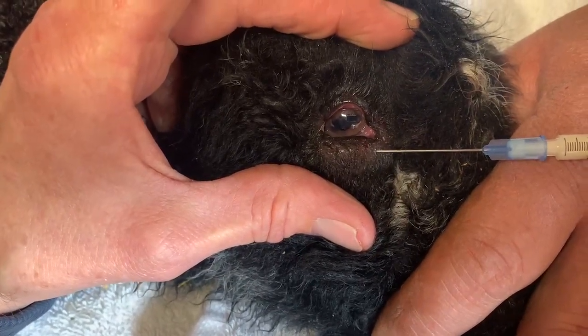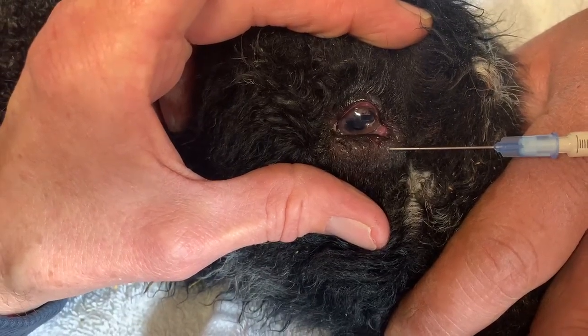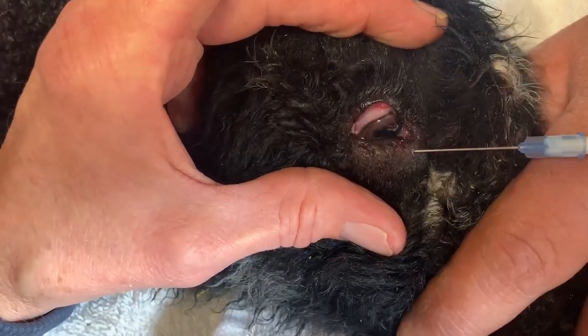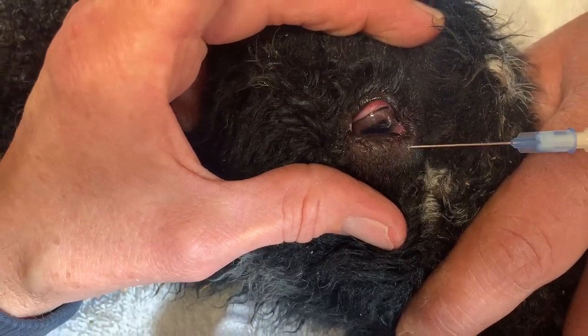I've got about a half a cc in there. I'm going to go for a little more. The reason we use the antibiotic is because it will diffuse more slowly out of that eyelid, giving it time to heal its rolled condition.